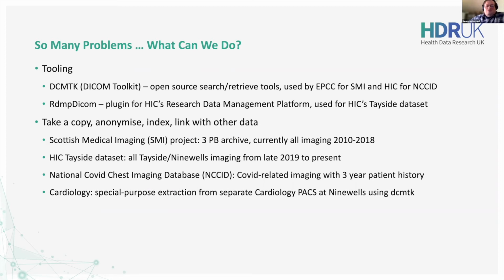We also did a smaller special purpose project where we pulled all of the cardiology images. And this, of course, is where we get into the small print: Scotland has a single nationwide PACS that has every MRI scan, CT scan, X-ray, all the others from radiology. But then cardiology departments are apparently a law unto themselves. They like to have their own separate PACS, which isn't connected to anything else, or has limited connections for various reasons. So that was a completely separate system to connect to for that particular project.